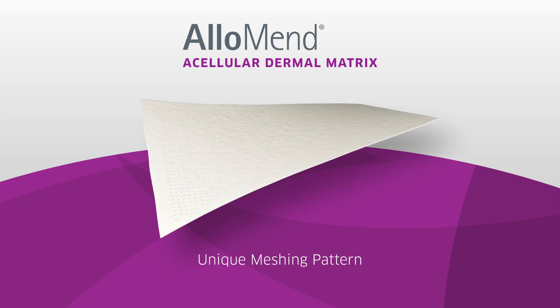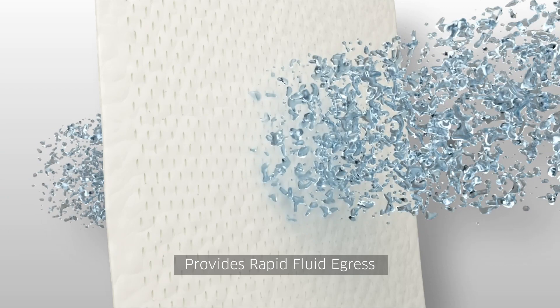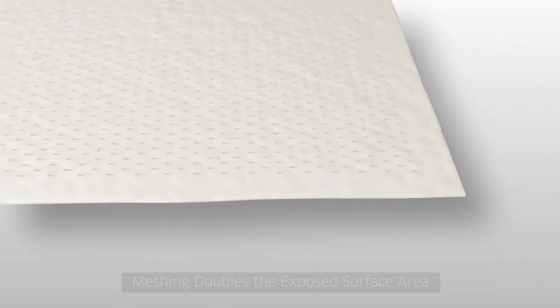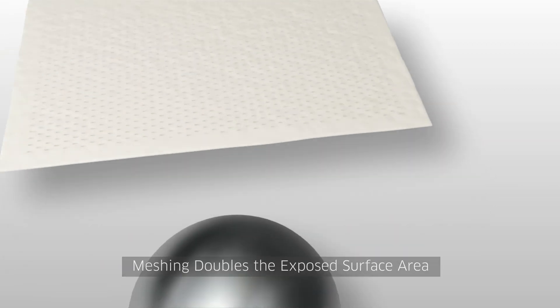AlloMend's unique meshing pattern enables rapid fluid egress through the ADM to help drain any trapped serous fluid, guarding against seroma formation, and doubles the exposed ADM surface area, translating into potentially faster incorporation.